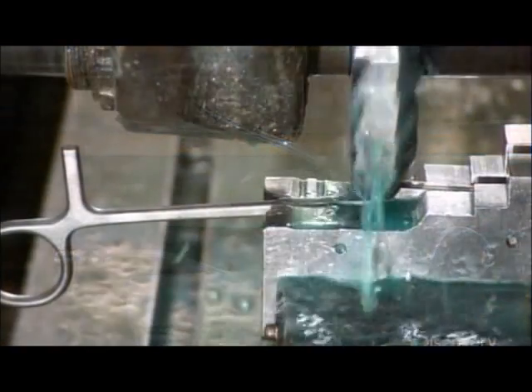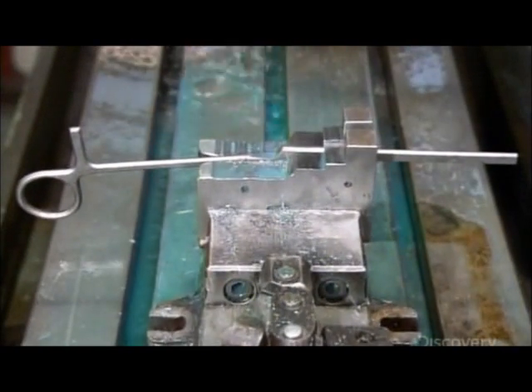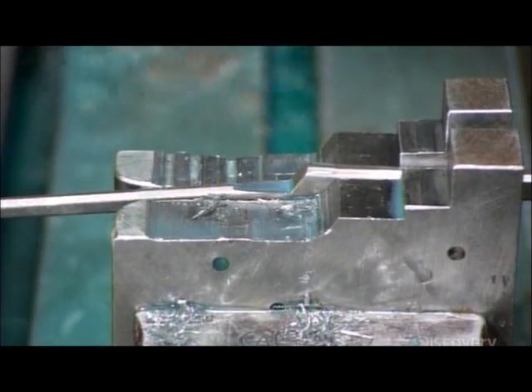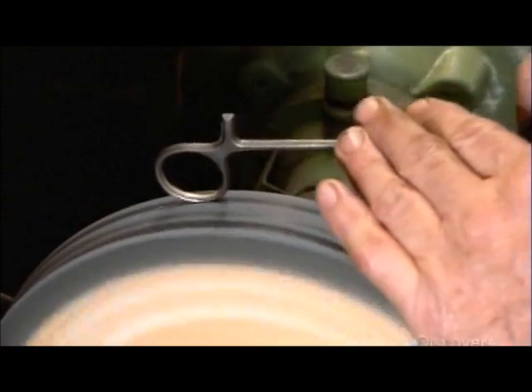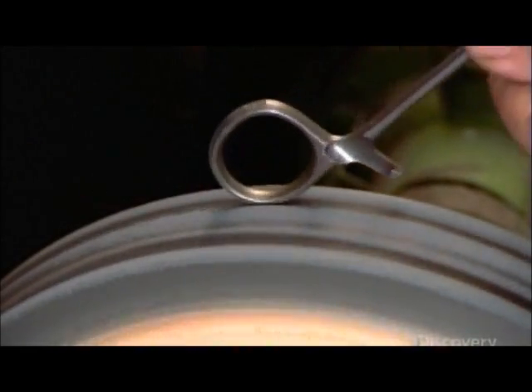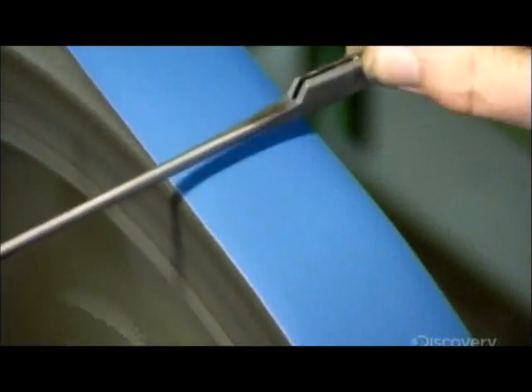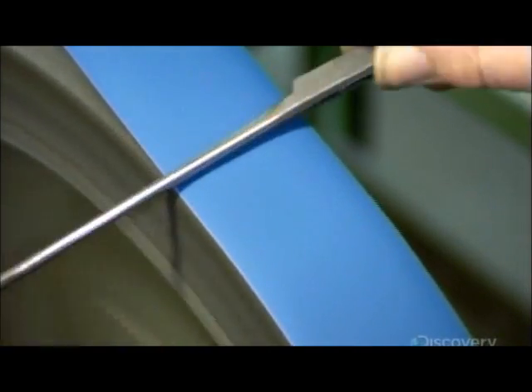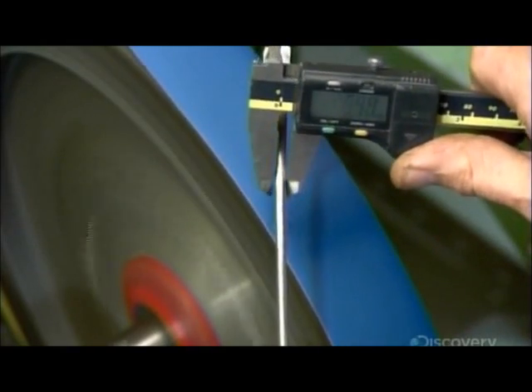Production now moves to the surgical clamp. It's used to block the flow of blood during operations and has a more scissors-like joint — rectangular instead of round. Mechanized cutters carve the joint and catches. A worker forces the finger bows against the spinning grinding wheel to remove surface imperfections. Precision is again critical as the worker grinds each of the tool's shanks to the correct thickness, measuring to confirm that the size is consistent along the length of the part.